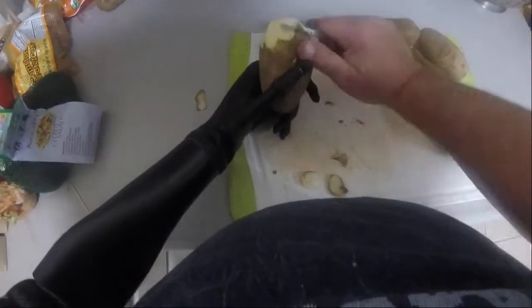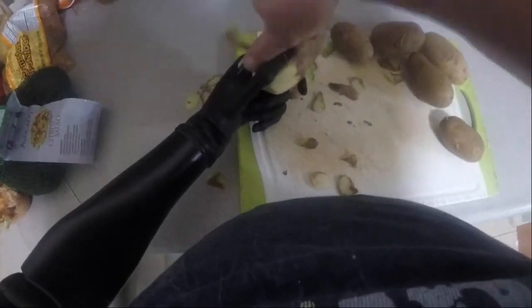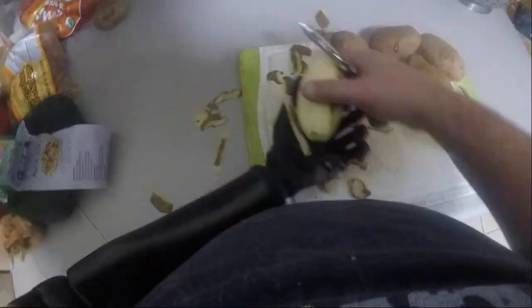As you watch me get started peeling some potatoes here, I'd like to address the question of how my arm is mind controlled. My prosthetic arm is mind controlled the same way my sound right arm is also mind controlled.